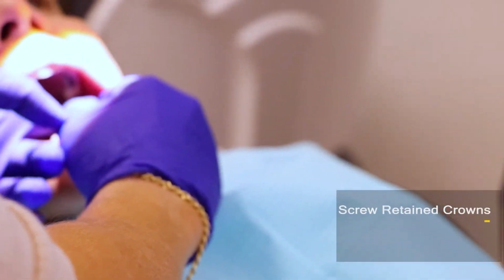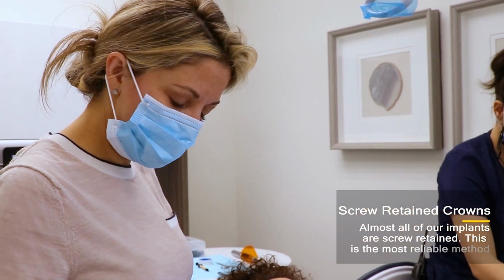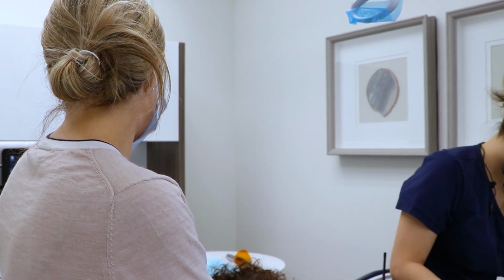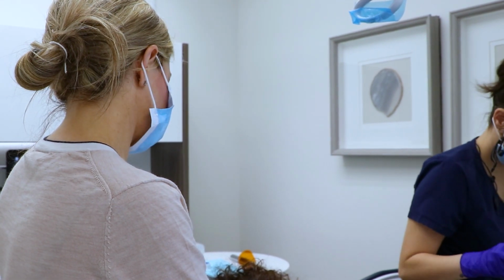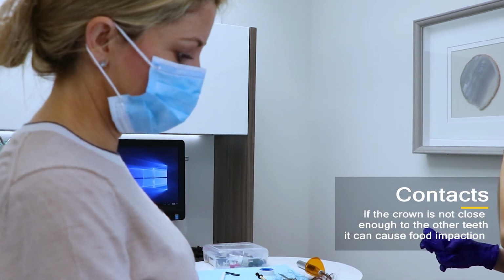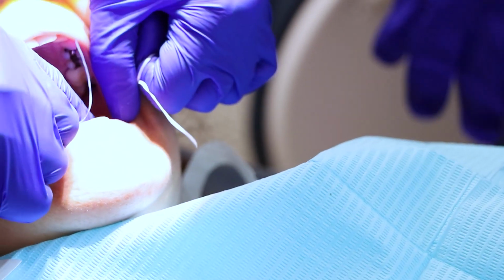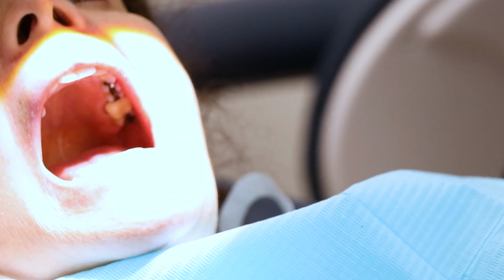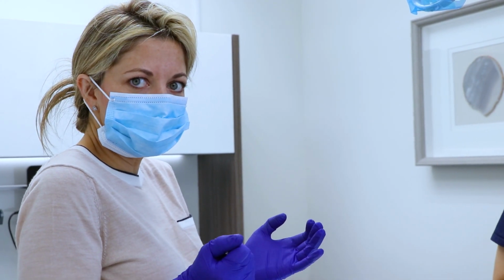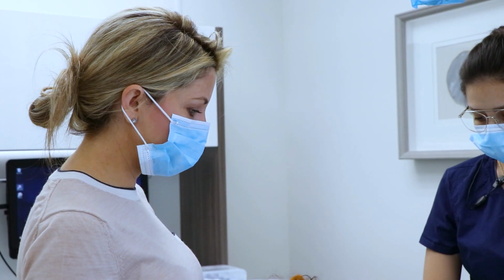The tricky thing about screw retain is the adjustments. There's some pressure here, okay? Don't bite yet. So you always want to check the contacts. Make sure that the contacts are there and that they're not too tight. So sometimes this can hurt a little bit because we're basically pushing the gums open so that the crown will sit into the gums and there won't be any space. So if you'd like, you can put anesthesia, but it goes away really quickly.